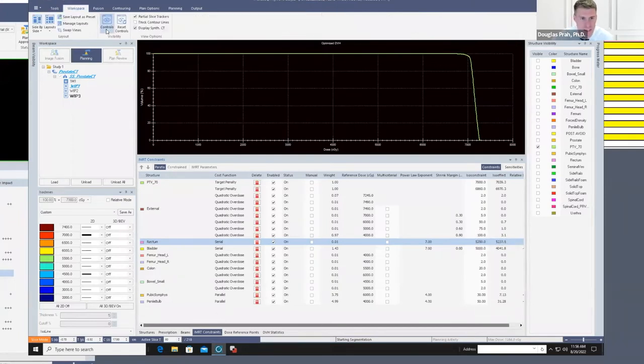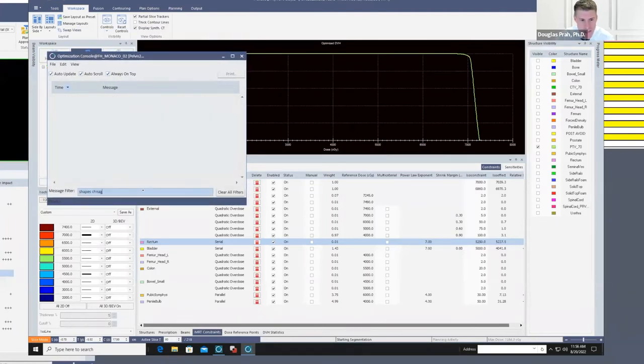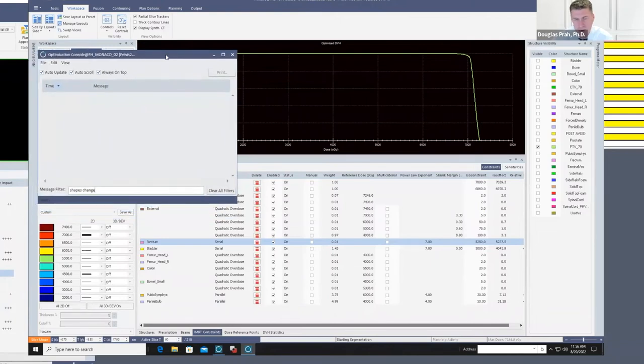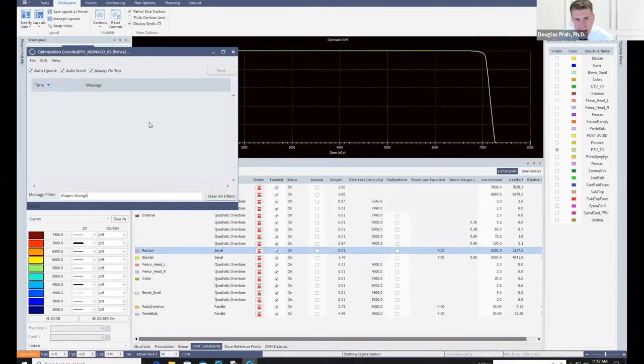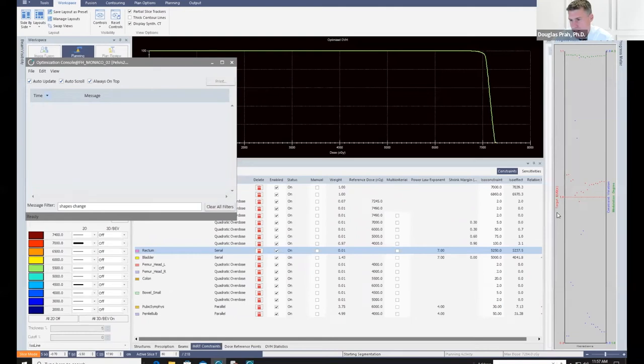So a couple tricks while this is running. I do use the optimization console here. You can type in here "shapes change" and filter. This will let you know what iteration of the segment shape optimization loop the optimizer is running through. I definitely will do this fairly often. It's nice to have it in the background. You'll see the progress meter here. You can see target EUD, which usually you want to be one, and then constraint violation, you usually want that number to get smaller. Usually what happens is you'll see that the plan ends up modulating more, so modulation degree will increase with time. If you're trying to find the overall progress though, I find that it's not very helpful.